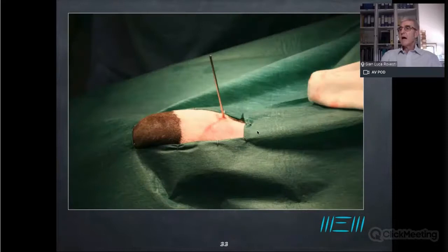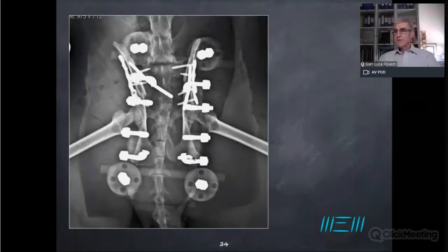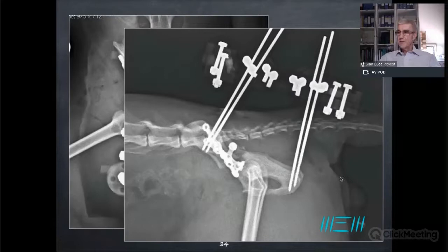So I prefer to stabilize the overall structure, very simple, very straightforward frame construct, 2 2-millimeter threaded pins on ilial wings like this, and 2 2-millimeter threaded pins on ischial tuberosities like this, okay? So we have the overall frame here. We can see through the fixator. Why? Because it's radiolucent, carbon and plastic. Much easier to understand what we are looking for. And this is the overall structure of the osteosynthesis.